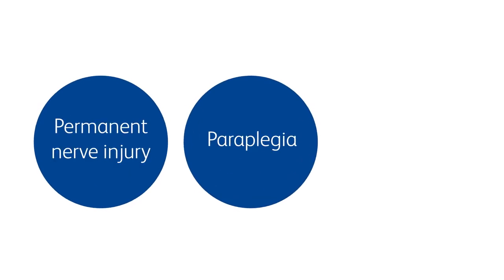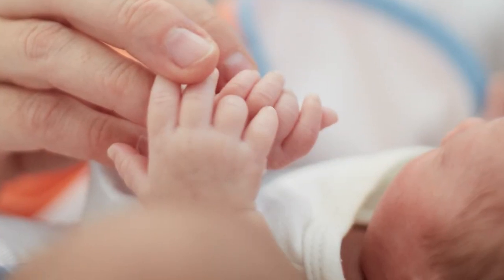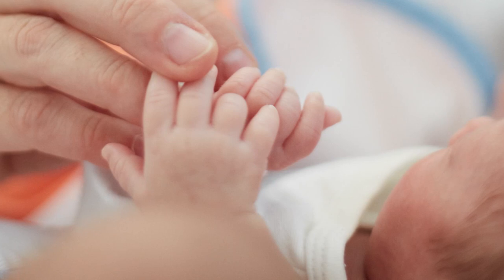A misconnection error can have devastating consequences: permanent nerve injury, paraplegia, even death. And one of these errors is simply one too many. But there is good news. Most of these errors can be prevented.